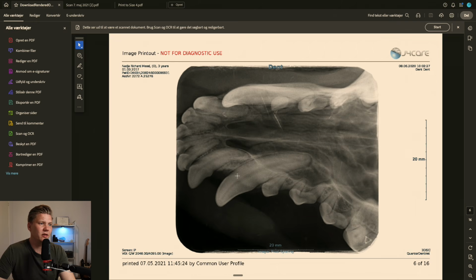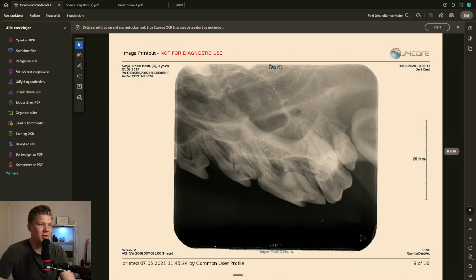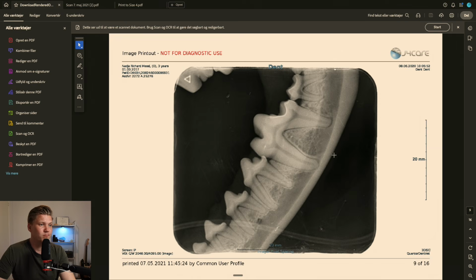So the other tooth here, the canine tooth looks all right. And the premolars here look okay. I'm a little bit concerned here. Is there some bone loss right here? And then when you have a look at the oblique view, I use this a lot to check the 9 and the 10. And you can see still, again, we have this bone loss right here, this dark area. So most likely this tooth is gonna have to come out, this one.